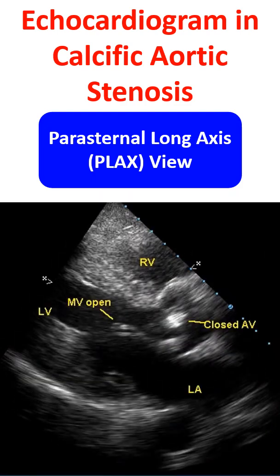Diastolic frame in aortic stenosis from parasternal long axis view showing aortic valve in closed position and mitral valve in open position. The marker is indicating the anterior mitral leaflet. Dense calcification of the aortic valve is evident.